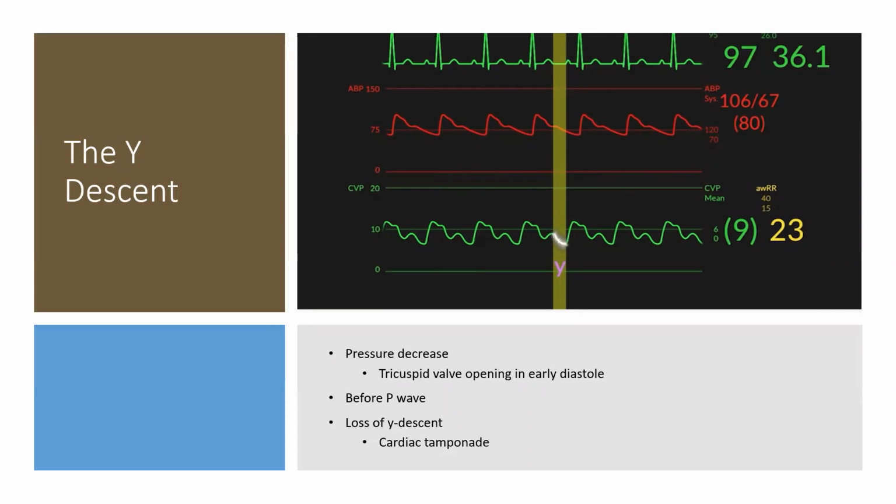As a matter of routine here in the United States, when you work in intensive care or any area which uses the monitoring of CVP, we always have to have a printout and locate the Z point so that we know that it corresponds with the reading that's being demonstrated in the monitor. Okay?